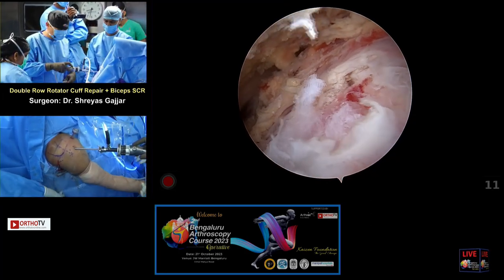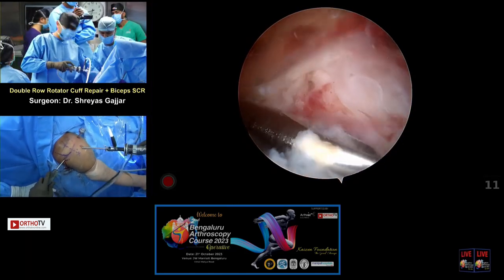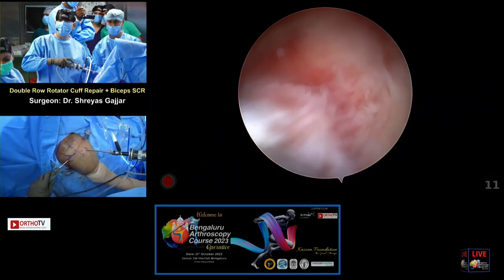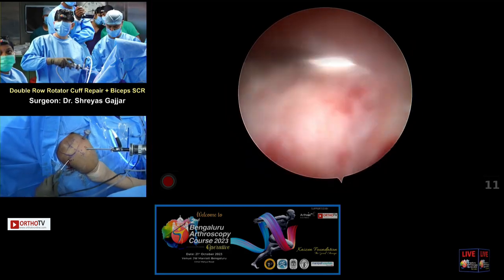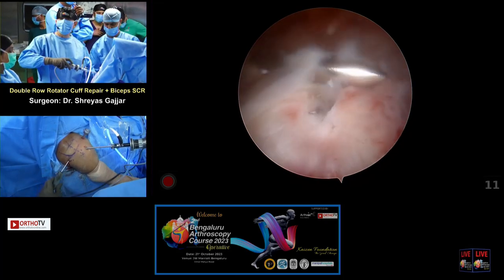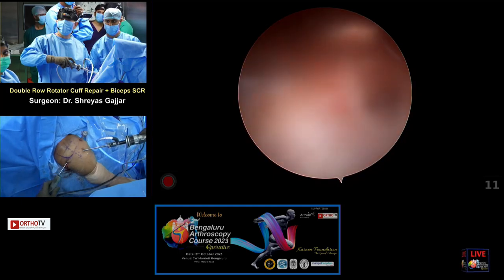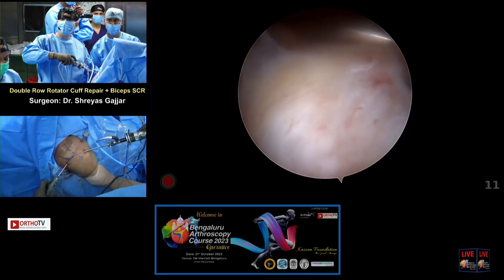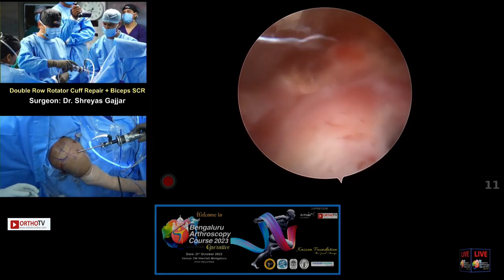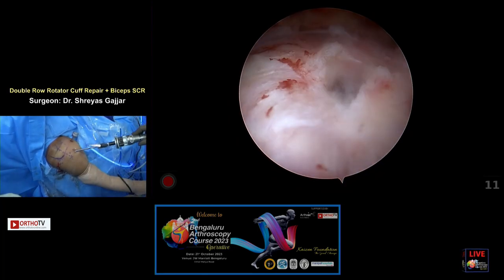Yeah. And okay. One second. So I'm just clearing the bursa off. Look at the direction of the shaver blade, where is the blade? Hold this please, hold the camera. Just turn the blade mouth towards the... Yeah, thank you.